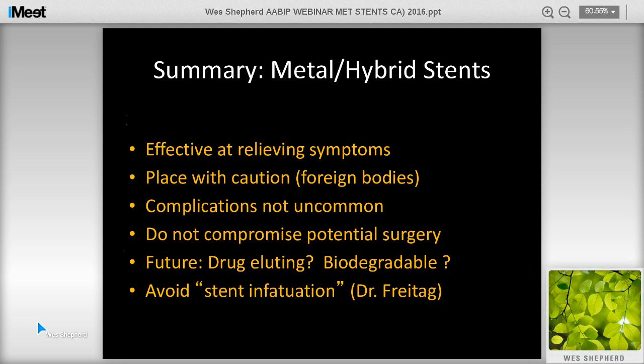Great. And we have an additional question from Dr. Rahul Sood, and he asks, do you perform routine flexible bronchoscopy 4 to 6 weeks post-stent insertion for treating granulation tissue and secretions? And if I may take the liberty of expounding on that further, what is your routine post-stent placement evaluation and monitoring process?